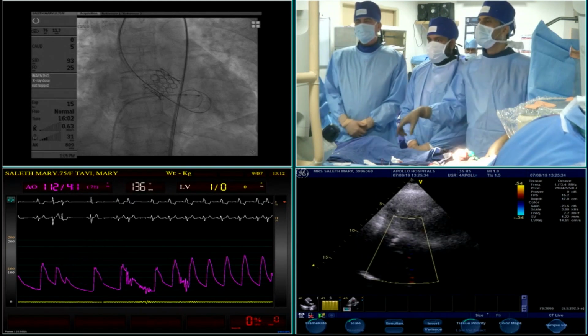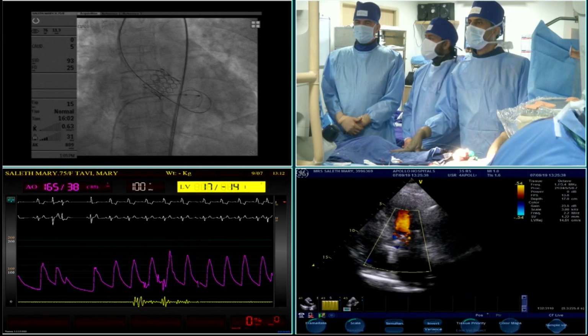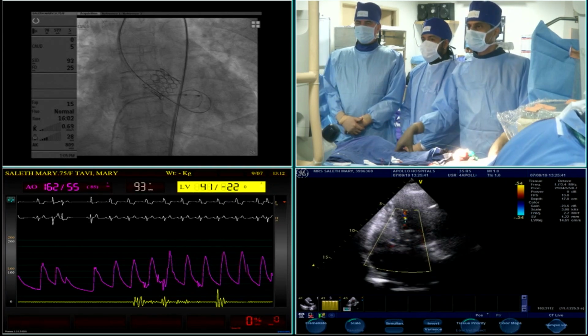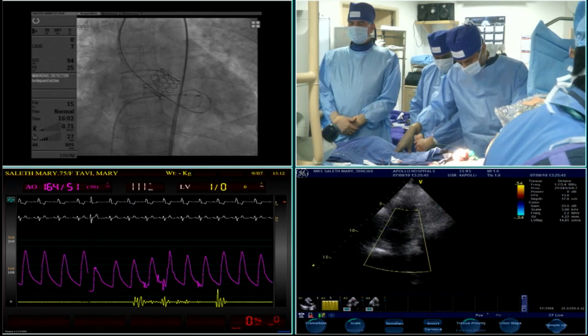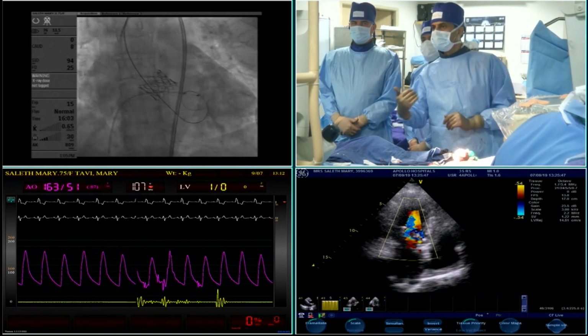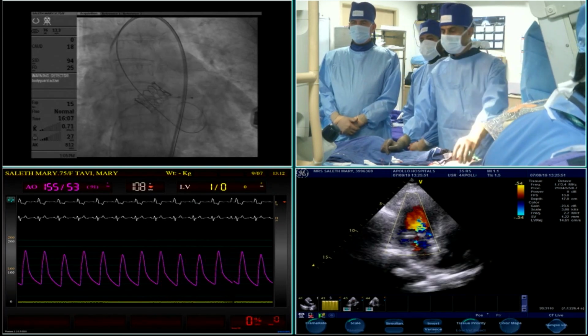The other aspect is that you don't need to keep injecting contrast itself. The first time, if you've injected and you found yourself in a position a little more caudal, your pigtail is just in the flow, then I don't even inject contrast at the time of dilatation, because it's more predictable when it expands. Yeah, I fully agree. Injection's not going to help you. Ready?